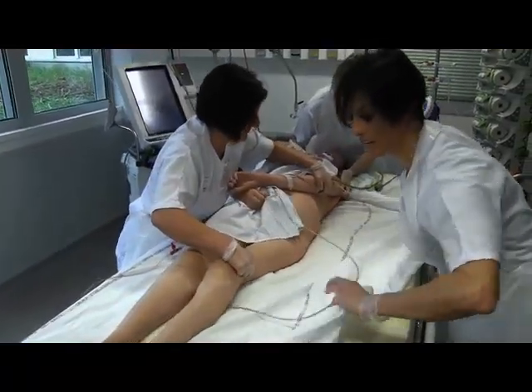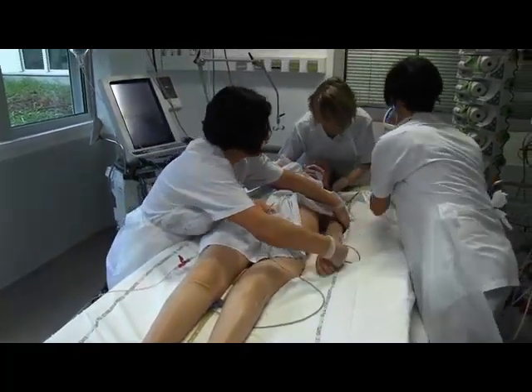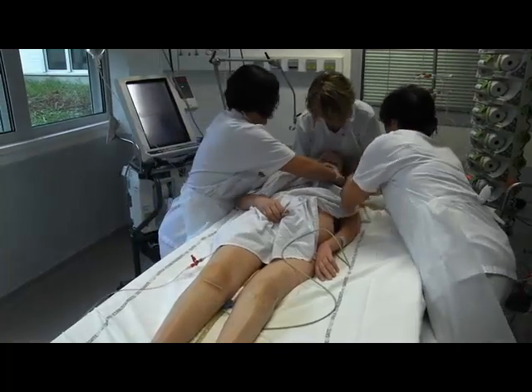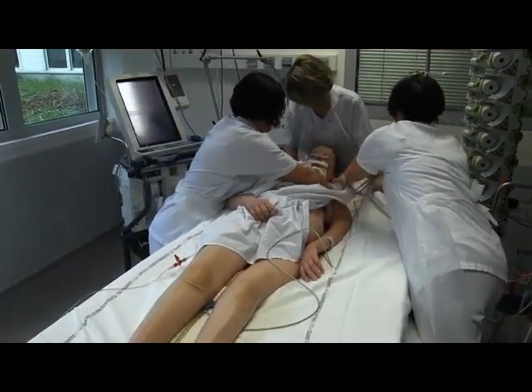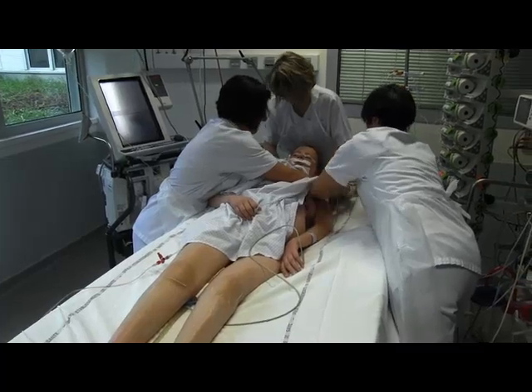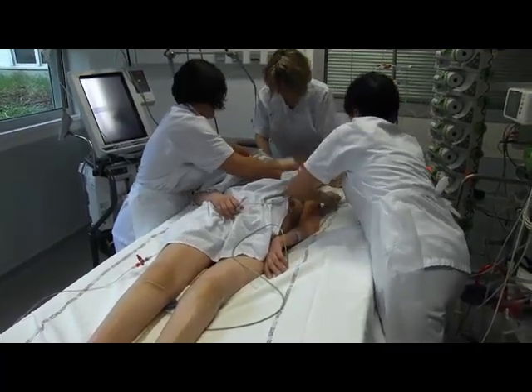To summarize the key points of the procedure: trained and experienced staff; 3 to 4 people; good preparation of the procedure; horizontal move; side lying position; complete proning; and post-proning installation.